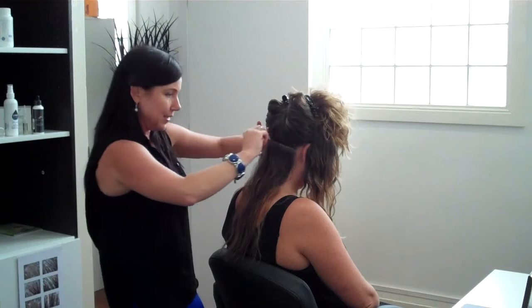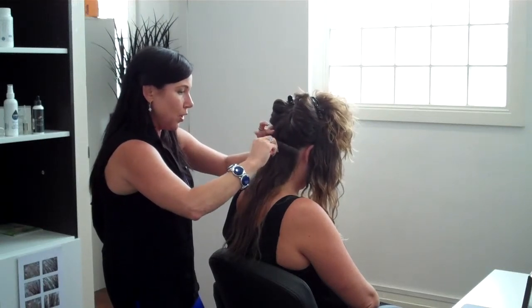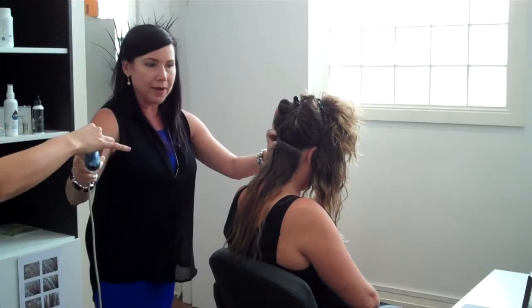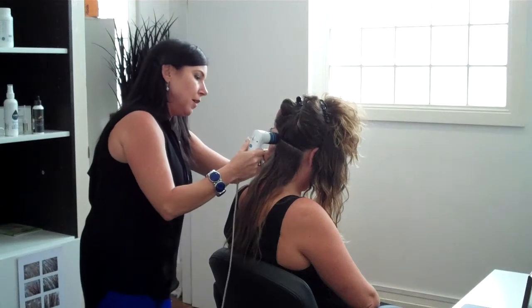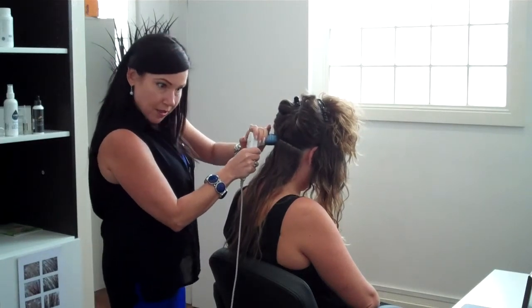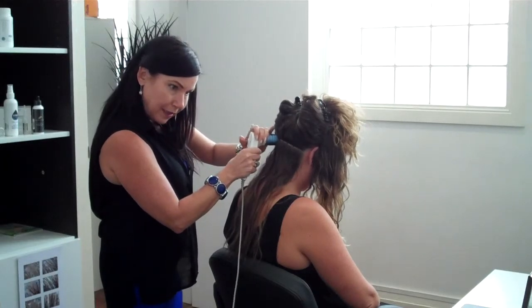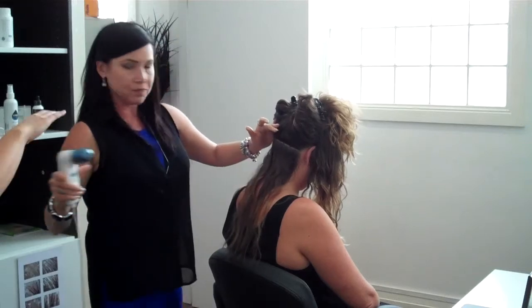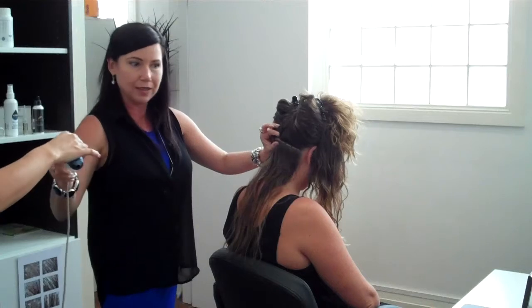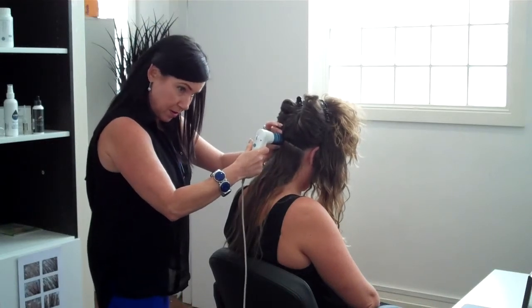You need to make sure you get a very clean section because you're going to take a picture of this with a video microscope. So we get a good separation and then we grab our video microscope. I can see on the screen what I'm doing, so I can adjust my lens into a nice, clean, clear picture and we capture. You just keep moving along — make sure it's clean, watch what you're doing, and capture.